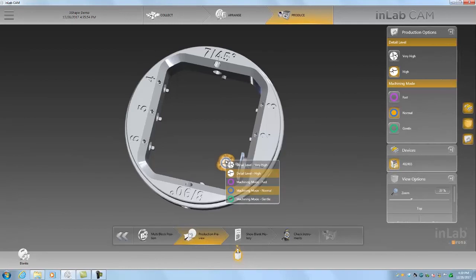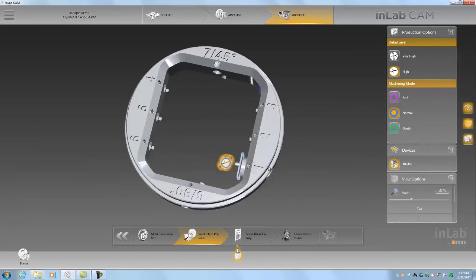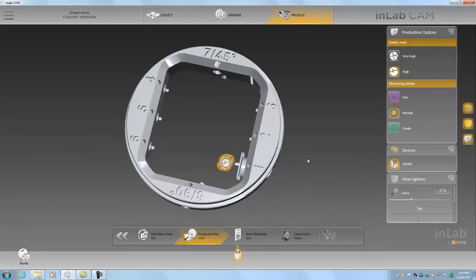In any case, the machining mode we can set here. It defaults to a high detail level with normal speed, which is generally what we're looking for. But you could set it to very high, which may use a slightly smaller tool bit to get that anatomical detail.